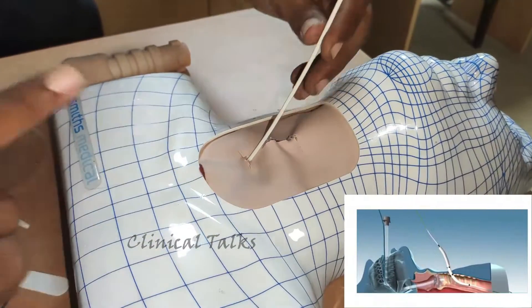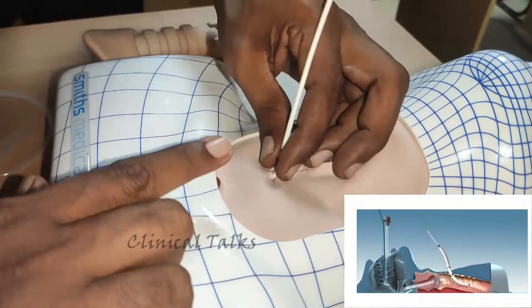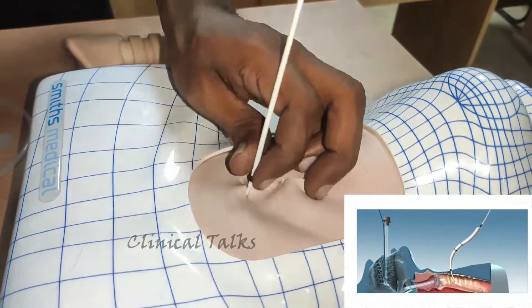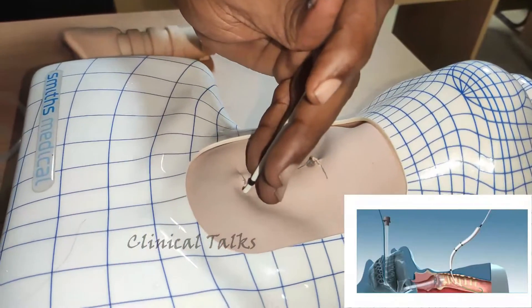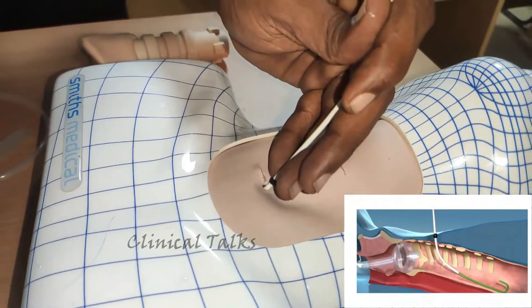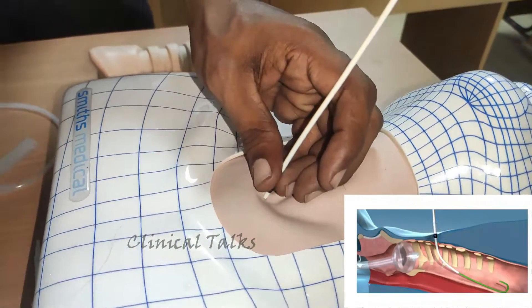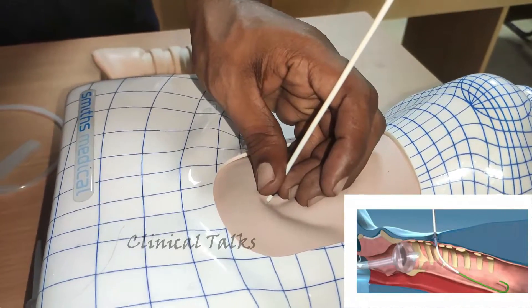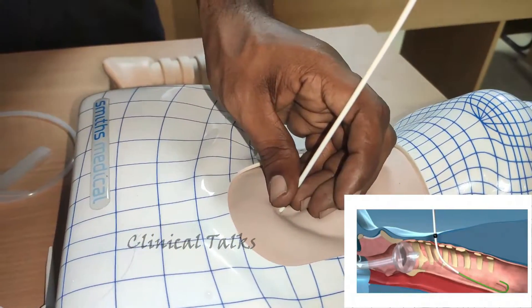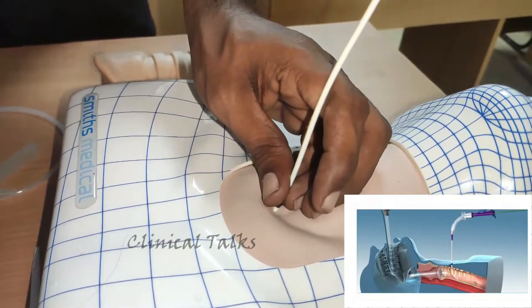The dilator is marked with a 38 French gauge and a maximum insertion depth mark. The dilator should not be inserted beyond the maximum depth mark. Care should be taken not to pull the guide wire guiding catheter assembly out of the trachea when removing the tapered dilator. Reposition the guide wire guiding catheter assembly and remove the tapered dilator, leaving the guide wire guiding catheter assembly in the trachea.